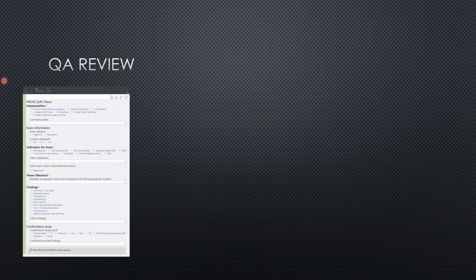The other example would be the FAST exam, because we don't have separate FAST and EFAST presets. So it all becomes an EFAST in QPath. So that allows you to go in and pick the FAST template instead, which is just a little bit more pared down. It's a little bit easier to fill out, very slightly, than the EFAST. So that allows you to do that.